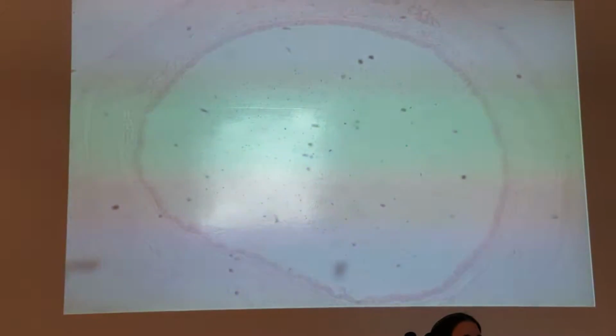All right, so what did we learn comes after the epithelial layer? We learned in the tongue, did it come after that? We had some other places. What comes after the epithelial layer? Lamina propria. On this, it's hard to distinguish, and I'm going to try to find another better slide on this. But here's our PSCCE. Right underneath it's going to be the lamina propria. And it goes all the way around. All the way up. It just gets lost up here.